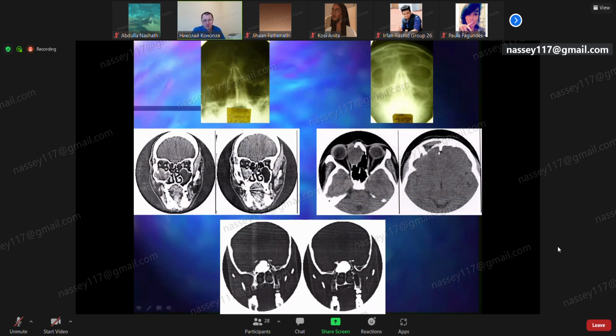We removed this osteoma through the nose, but it was very, very difficult because it's bony, and it's big, and it doesn't pass through the small opening of the sphenoidal sinus. It was necessary to do fragmentation of this tumor inside the sphenoidal sinus. Finally, this operation was successful.